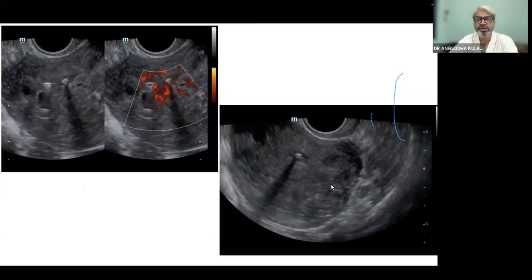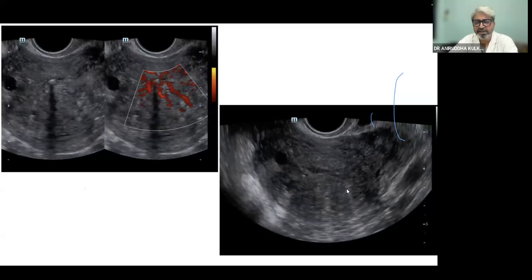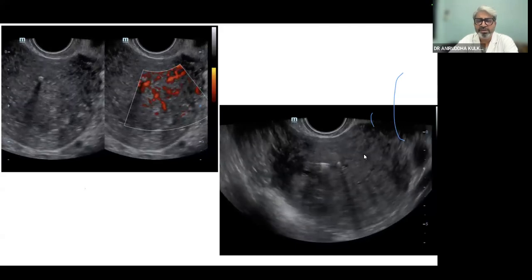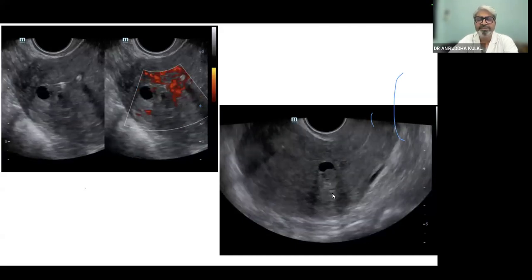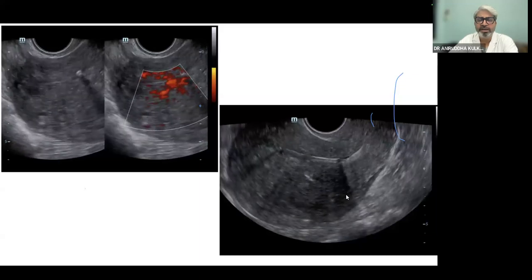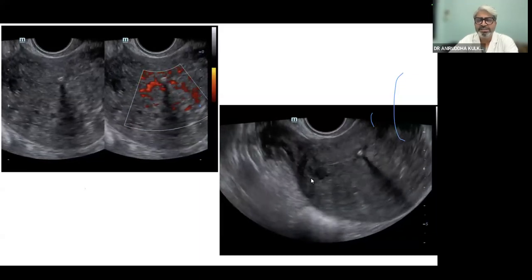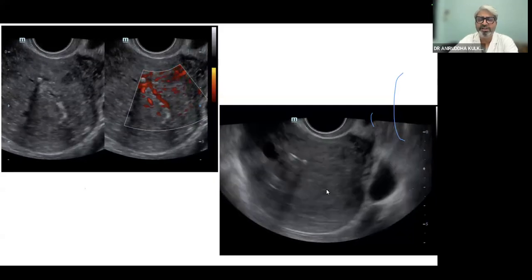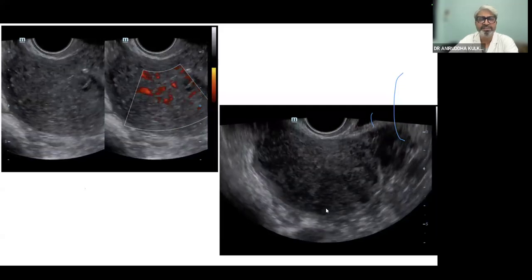On many instances, you can find tiny cystic spaces which show comet-tail artifact. In this individual, you can see that there is a Mirena within the cavity and there is asymmetrical thickening of the posterior wall. Not only that, the endomyometrial junctional zone is indistinct and there are features of adenomyosis in terms of a mottled appearance in the posterior wall. Adjoining to that, we can see cystic spaces, which also have a small hyperechoic area within, which could be a feature of a clot within the adenomyotic cyst.